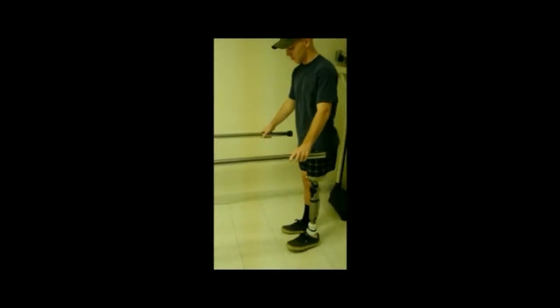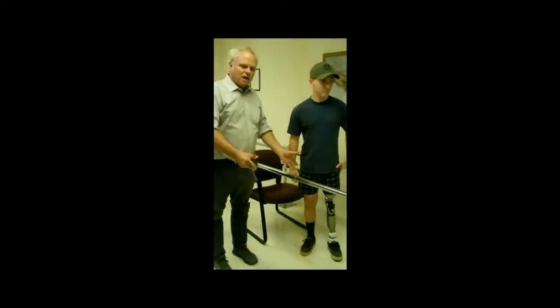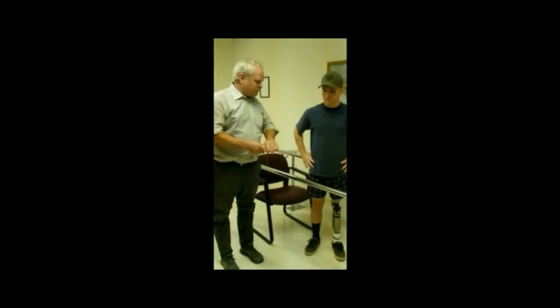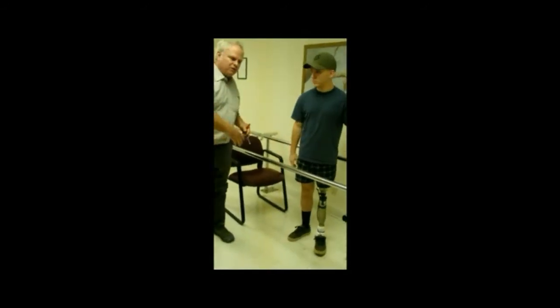Now, important part at this aspect, because we're doing a test socket fitting. Fortunately, he's young and willing and putting a lot of pressure in the socket. If they do not load the socket, they do not get a release. If they do not get a release, back that off until it's fairly loose and come in like a quarter of a turn. And once you come in that quarter turn, it'll go off and on. And then you can teach them how to get into swing. If they've never experienced swing, they won't know the difference between stance and swing.